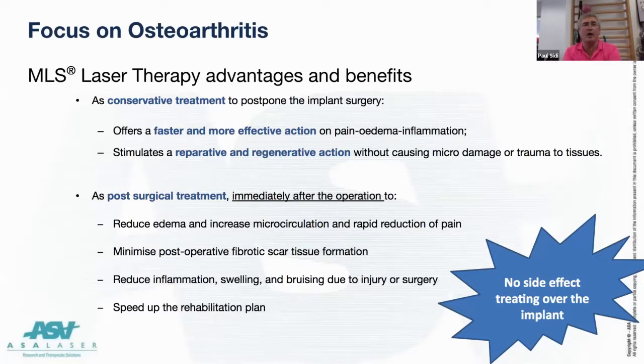area. It offers a faster, more effective action on pain, edema, inflammation. That's the important thing. We're going to get the pain down. We're going to get the edema down. We're going to get the inflammation down. It stimulates reparative and regenerative action without causing micro damage or trauma.